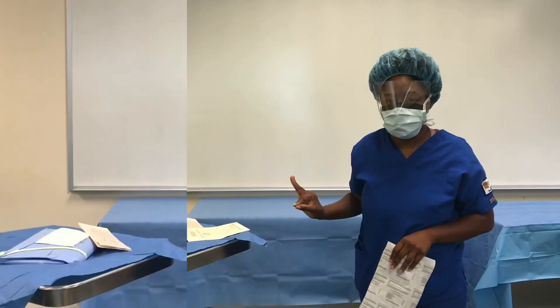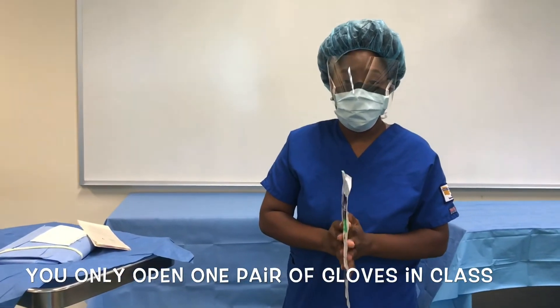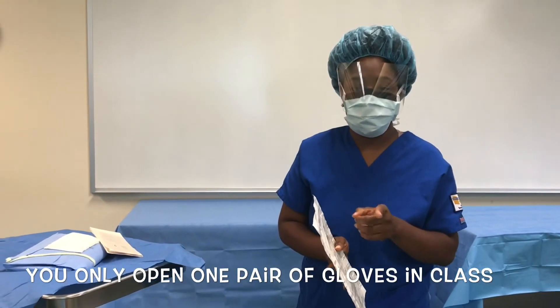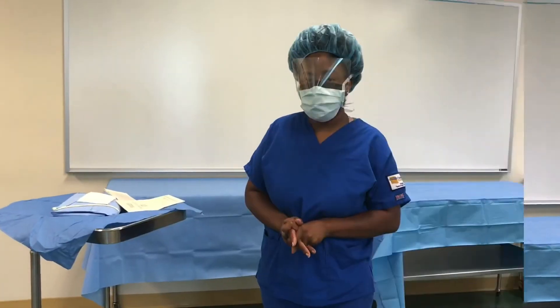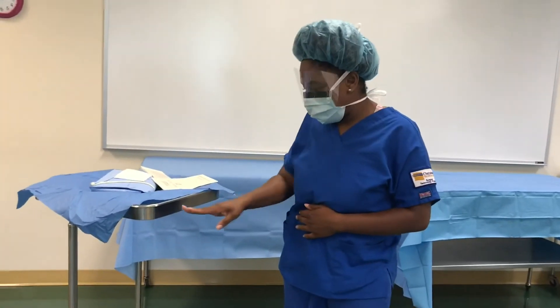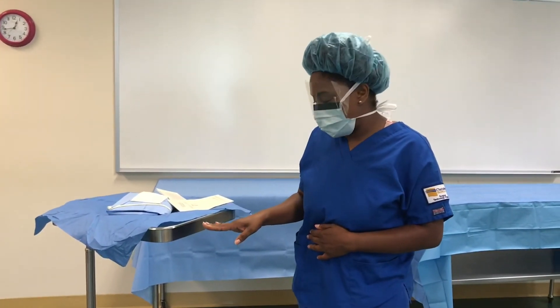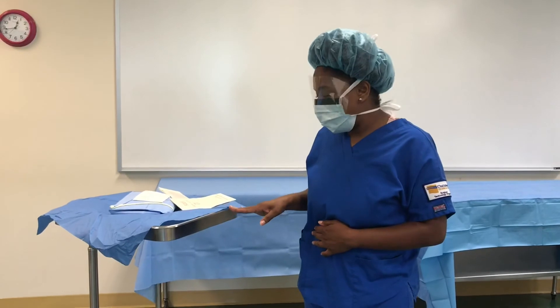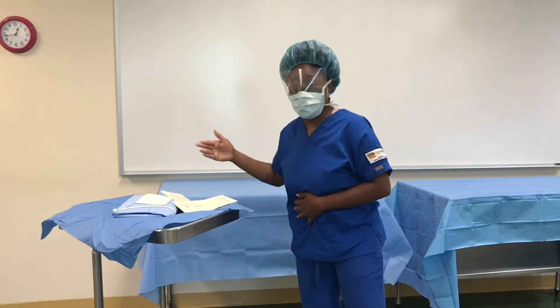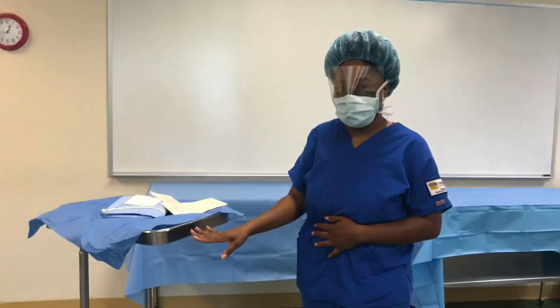Another thing to keep in mind: you are going to be opening two gloves onto your Mayo, so as you can see I do have a little open space on the Mayo showing. When opening up anything over this cover, try to stay over the covering without touching the exposed area here.